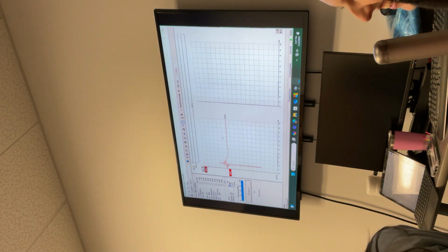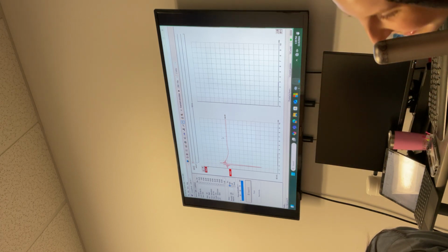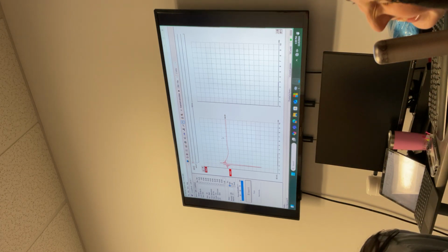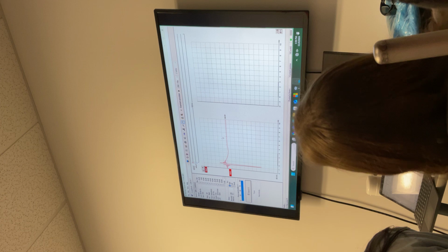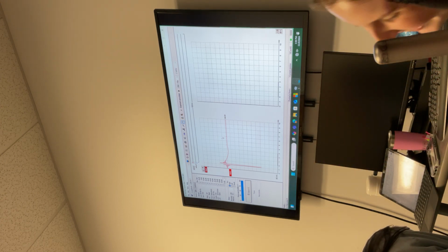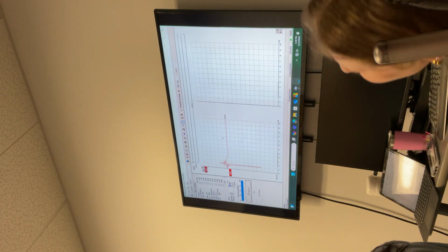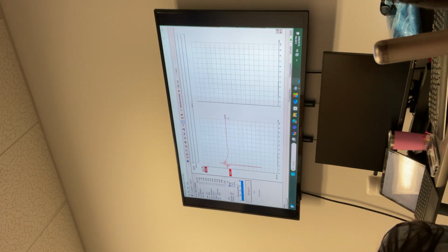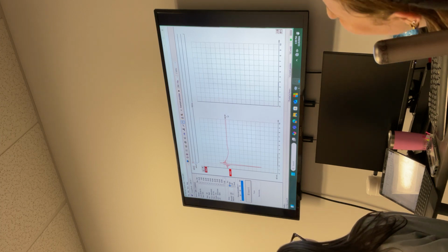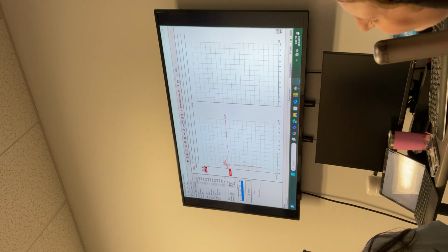This is rarefaction. Good. And what stimulus is this? This is an 80 dB HL stimulus. What is it? It's a click. Yes, thank you.